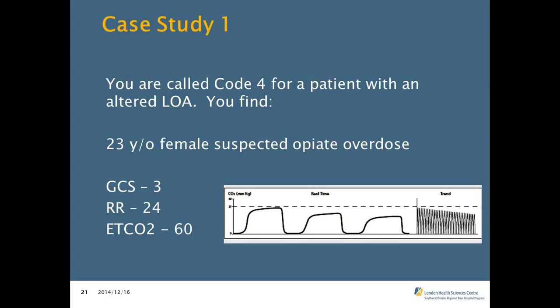So another question has come in and is asking, what would the EndTidal CO2 look like for a silent chest?